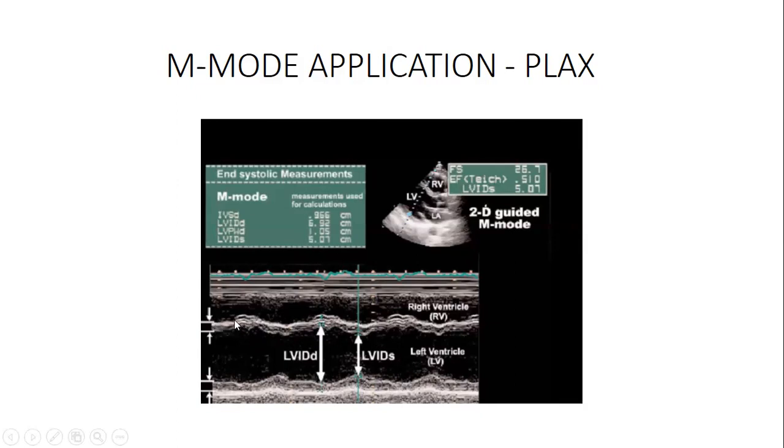This is the septum. Here we have the left ventricular posterior wall, which is this one.